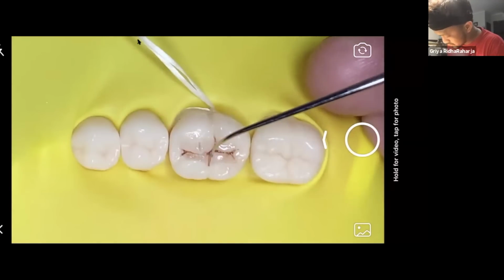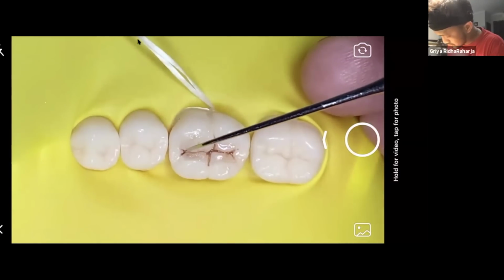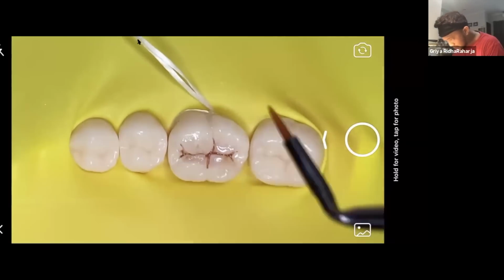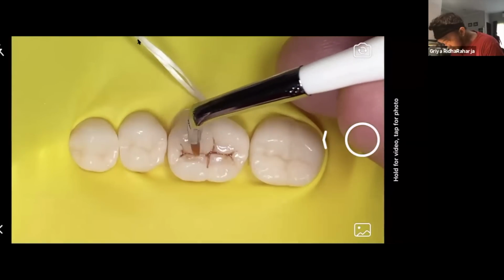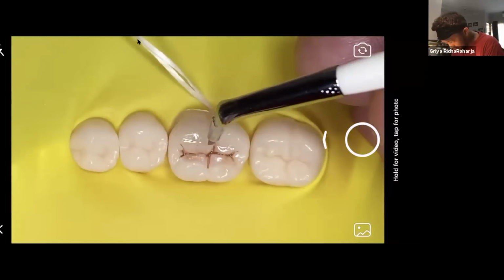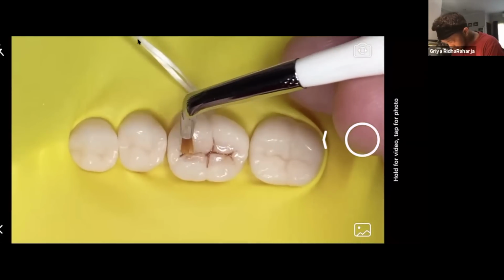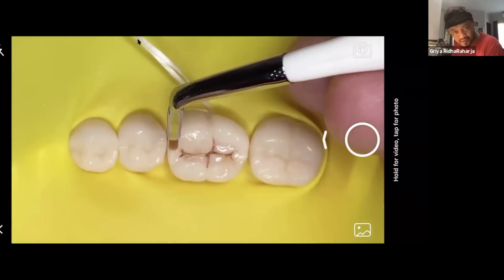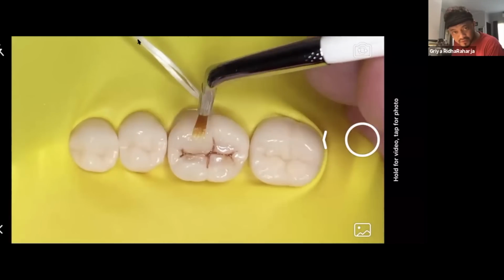Yep, sorry. Sorry, I can't see. Sorry. Hello. Okay, wait. It's a little bit difficult to demonstrate, you know. Sorry.